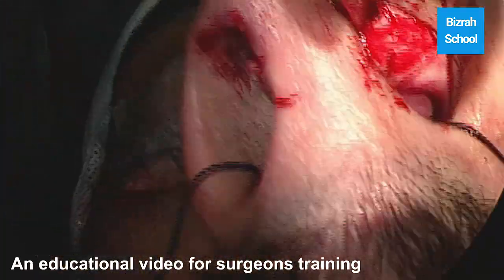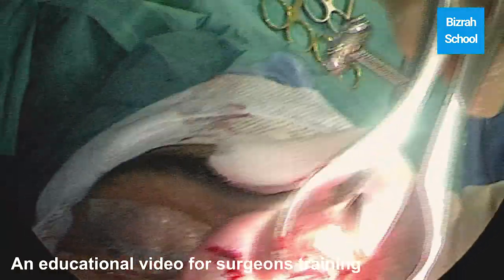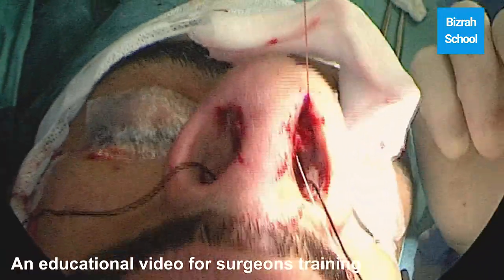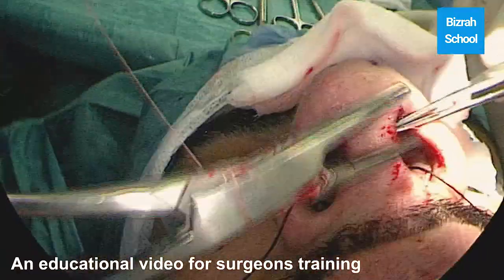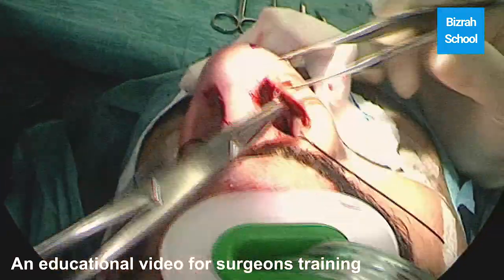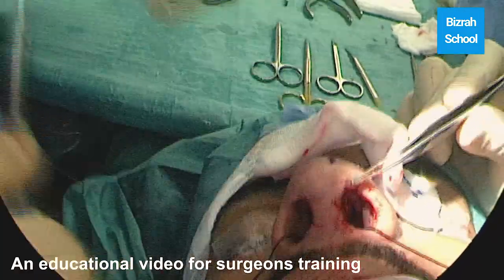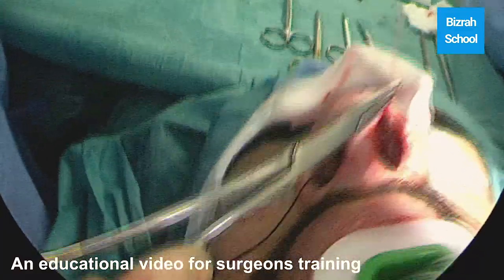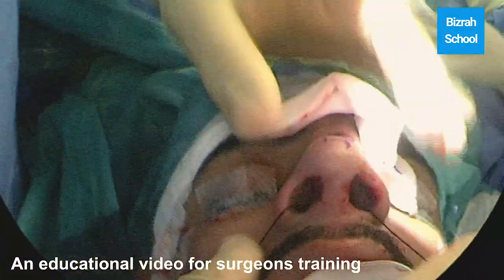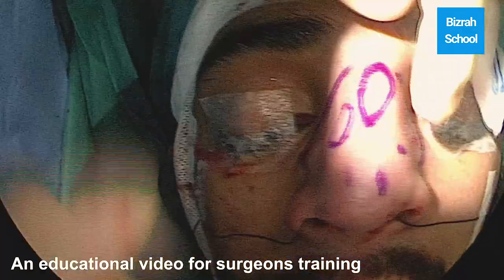That's it — and we'll suture it now. It went inside and we'll suture it — make sure it stays inside. Easy, straightforward. Insertion of spreader graft — exact pocket between the upper cartilage and the mucosa below — exact pocket lateral to the dorsal septum. Pushing the spreader graft in between and then closing the incision, with sutures going through the graft in order to keep it in place. Much better now — it achieves nice, more symmetry. More symmetry in this area by using the bilateral spreader graft.